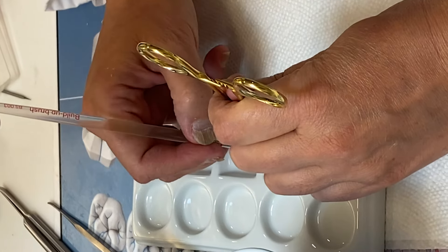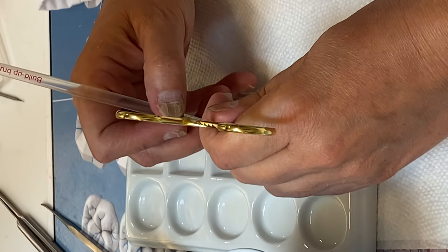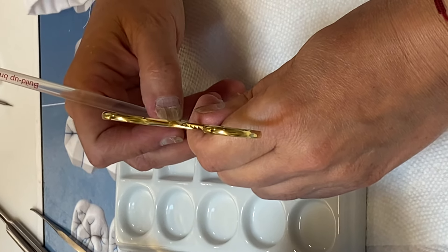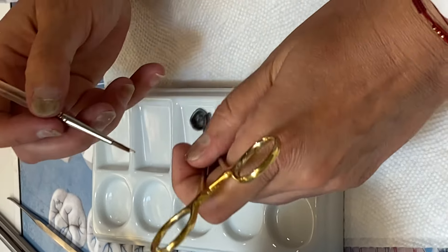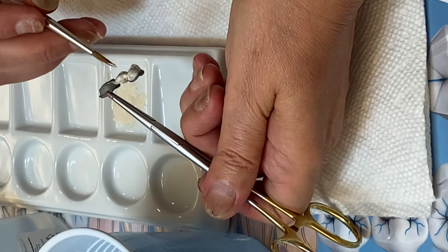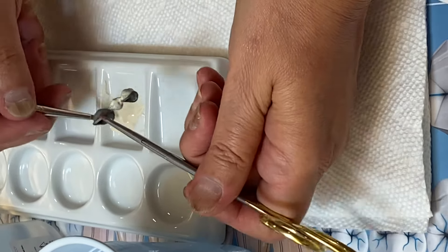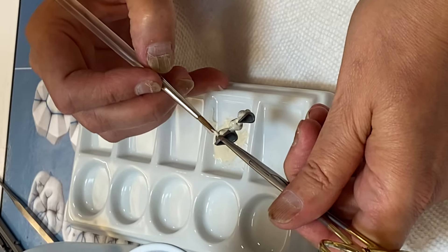On the pontic, we want to cover the underneath side, because this is the side also where we're going to put dentin porcelain. And then we're going to cover the molar.